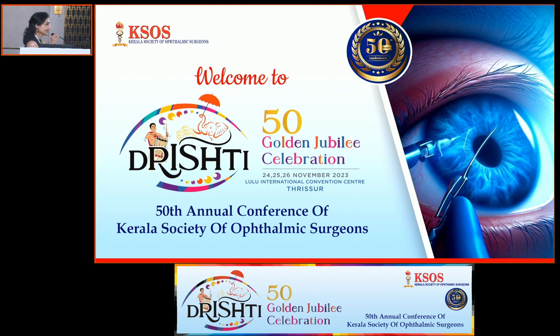So can you do visco dissection instead of hydro? In these patients, you can do, because I didn't do any hydro in any of these patients. What I do is that when I go with the bimanual irrigation aspiration, I try to tease out the lens matter, and luckily because the lens matter is soft, it will come out as a whole, and you can eat it with the bimanual irrigation aspiration.